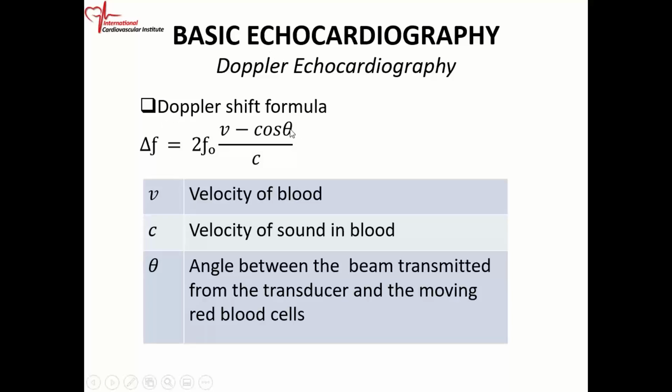Now, this angle theta is the angle between the ultrasound beam that is transmitted from the transducer and the moving red blood cells.